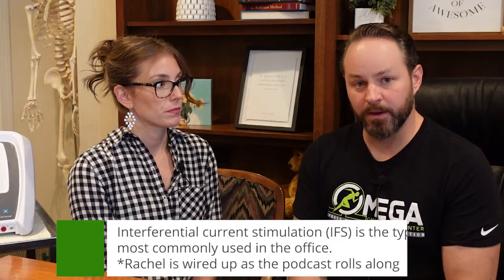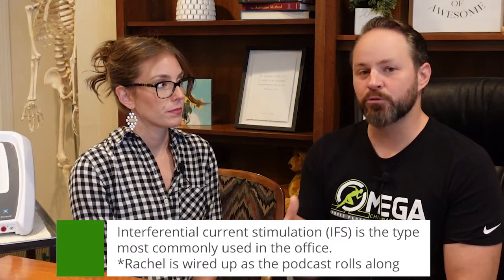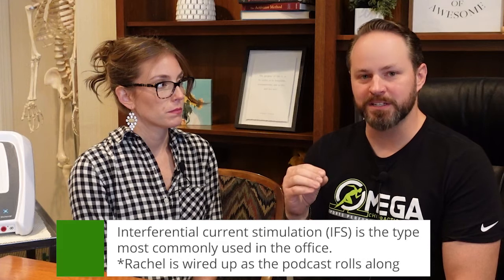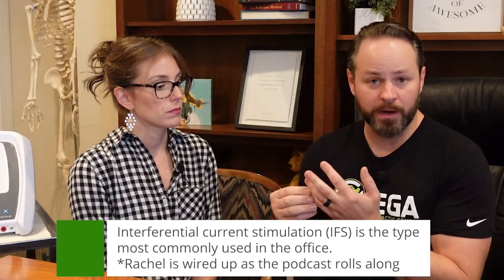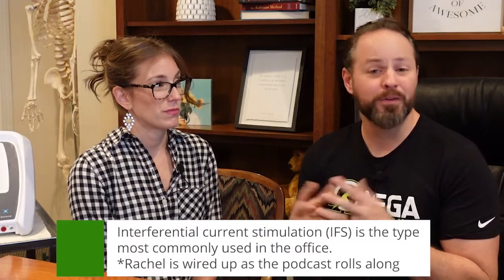Sometimes when you have a super injured area, like a broken bone or something like that, we'll do a microcurrent. What it does is it's not as intense. You won't really feel it. It kind of maybe feels like a tingle, because if it's fractured in there, I don't want to cause any movement in the fracture, but I still want to stimulate healing. Yeah, that wouldn't feel very good. That's what microcurrent is designed for.